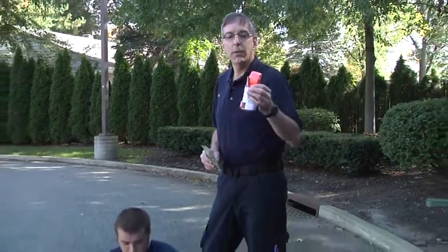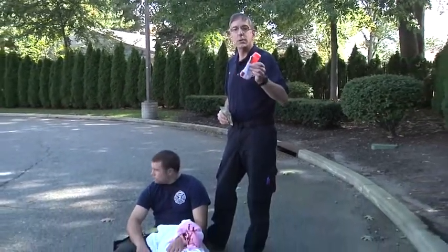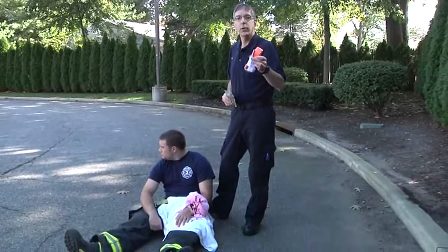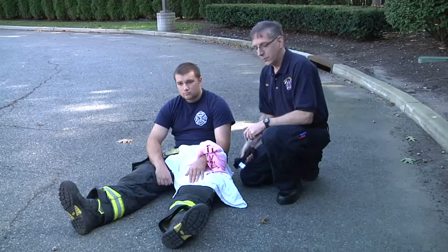One important thing about the CAT tourniquet is you should not leave it packaged in its wrapper from the manufacturer. You should have the CAT tourniquet unwrapped and ready to use. Now we'll look at application of the tourniquet.